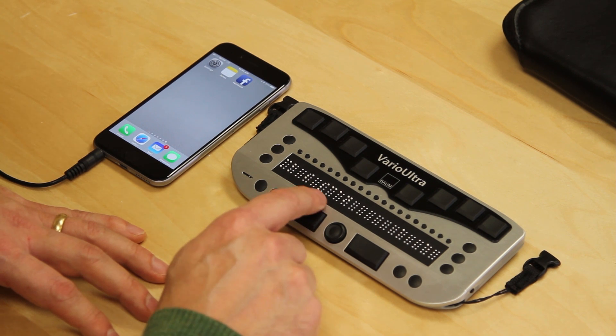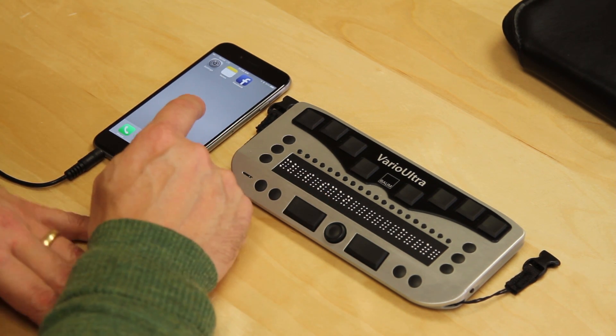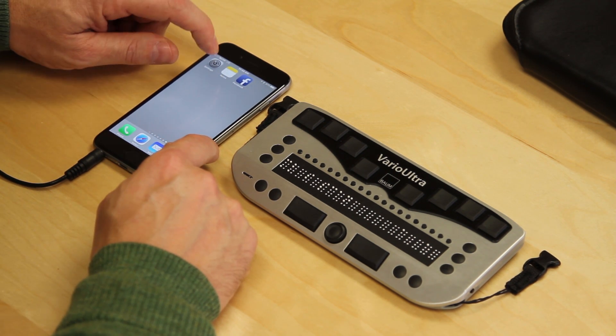Once Bluetooth is on, it automatically goes down to the next line, which is scan. When we do scan, it's going to be looking for other Bluetooth devices that are in range. Before I do that, I have to turn our attention briefly to the iPhone. I do have VoiceOver switched on, so this is going to speak as we go.